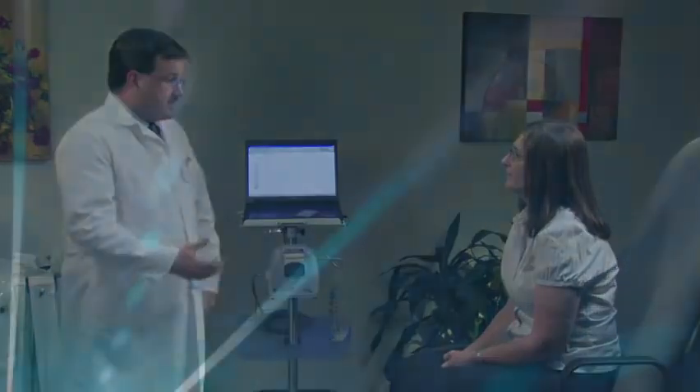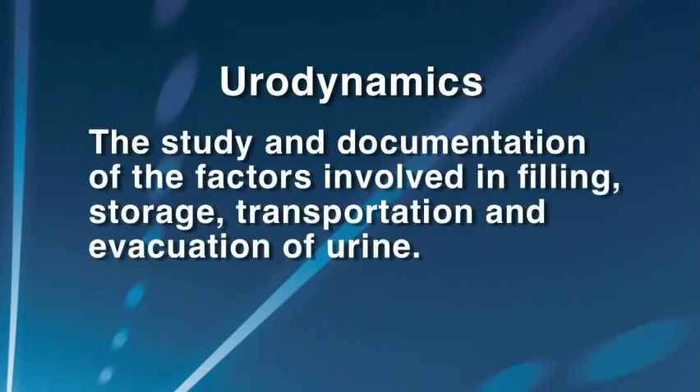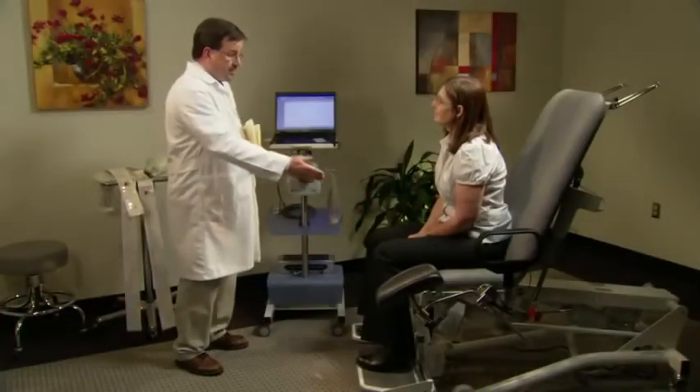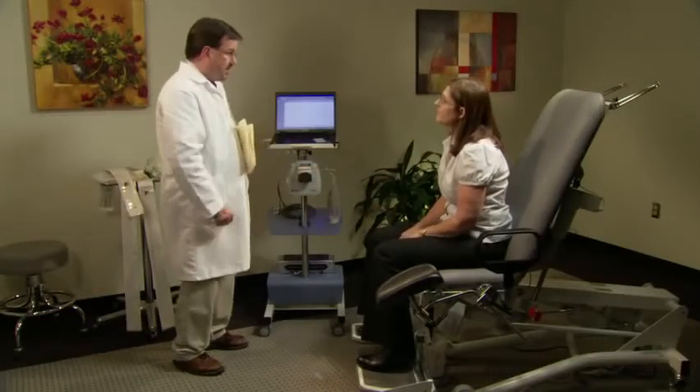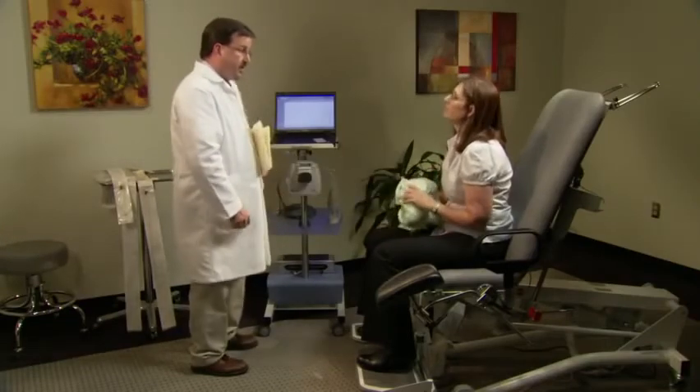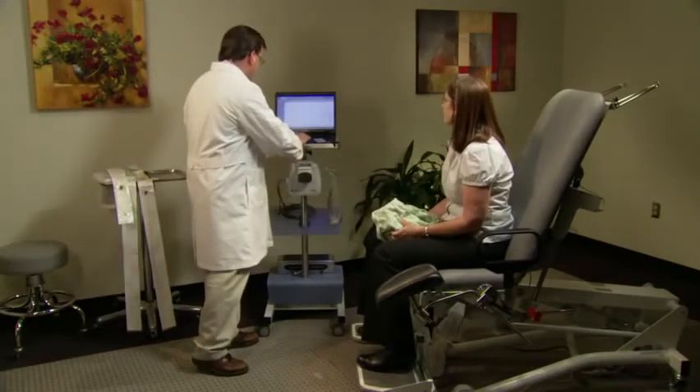Urodynamics is a diagnostic study of the filling, storage, and voiding of urine. With urodynamics, you can also evaluate how the pelvic floor muscles and abdominal muscles affect the bladder's ability to store urine. The nurse instructs Mrs. Jones to empty her bladder using the funnel on the Sonesta chair, then undress from the waist down and put a gown on.